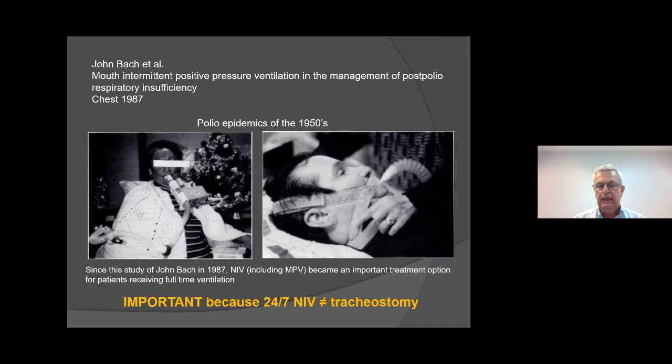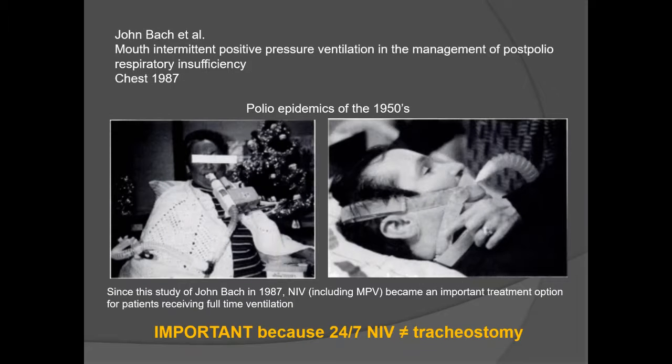This is really a very, very important paper in the history of home ventilation, because since this study of John Bach in 1987, non-invasive ventilation, including mouthpiece, as you can see on the two pictures, became an important treatment of those patients receiving full-time ventilation, because until that date, patients who had to receive daytime ventilation always received tracheostomy.